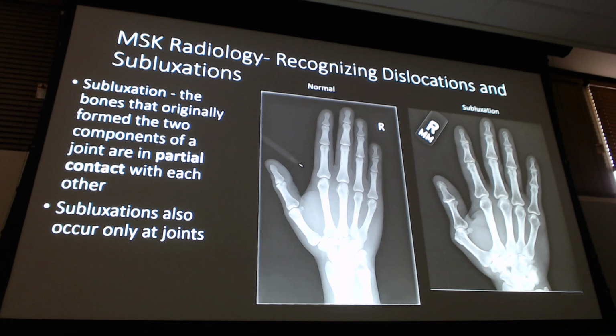So just remember, distal. When the hand is like this, you're naming it for the distal fragment, right? Don't think distal is always down here. In anatomic position, these are the distal areas of the hand and the wrist. But the x-ray is always going to look like this. This is the distal area, so just remember that when you're naming things, okay?